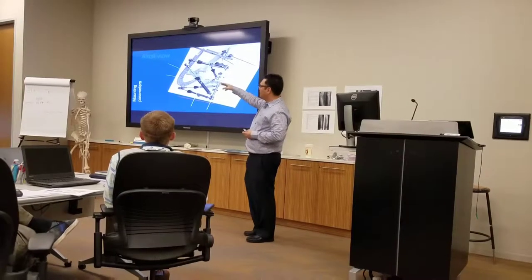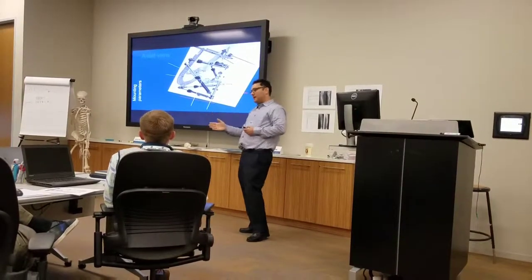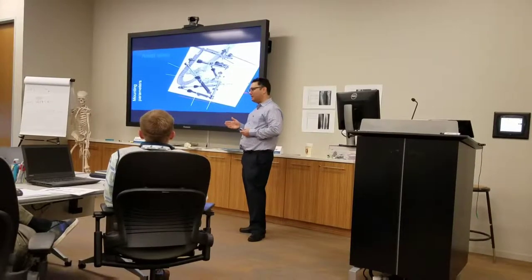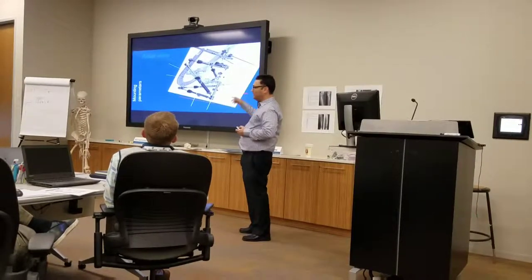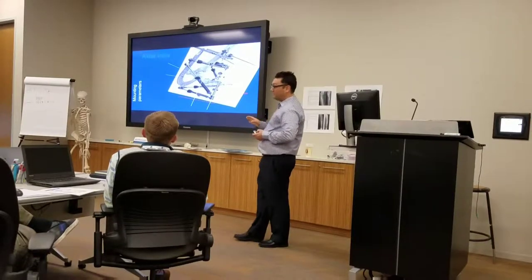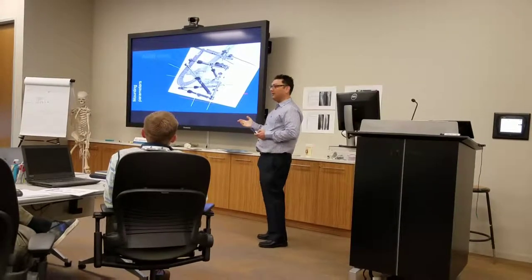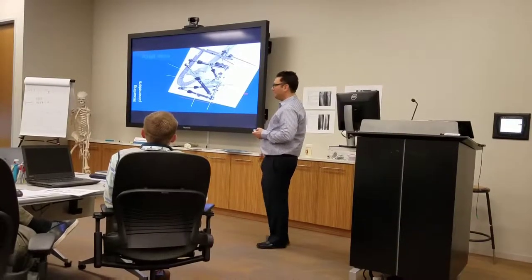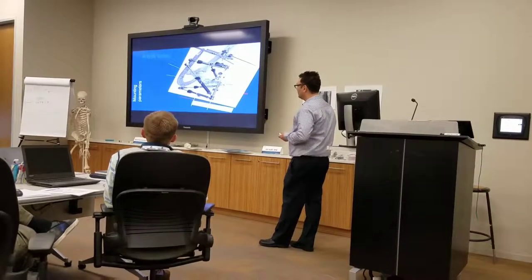With a proximal reference, it's very hard to know: are you in the middle of the calcaneus? What's your axis along the calcaneus? You can get a decent view of a distal reference of the second. So don't let anybody convince you to do a proximal reference. Even though it's correct, you can do a proximal reference. I've yet to see really good x-rays on proximal reference measurements that are convincing that you're getting good measurements.